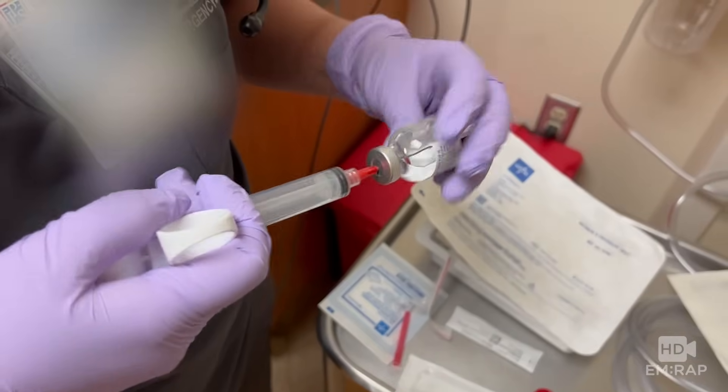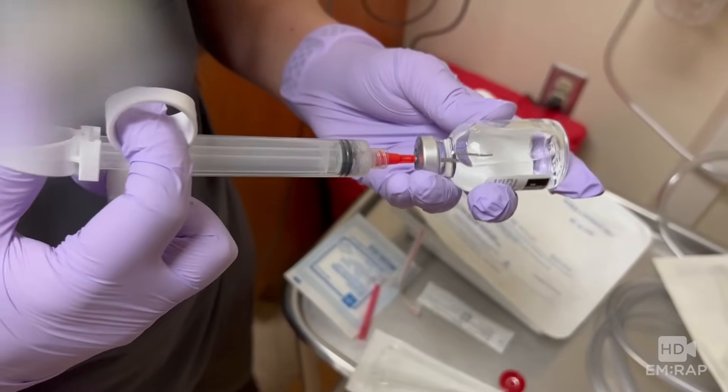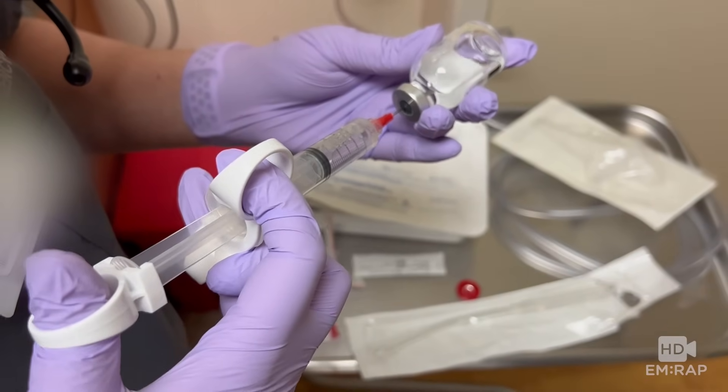You can use this time to draw up the lidocaine with epinephrine. A control syringe allows for easy, single-handed aspiration and injection. It's great if you have them available.